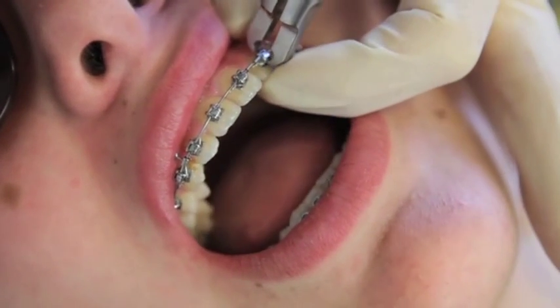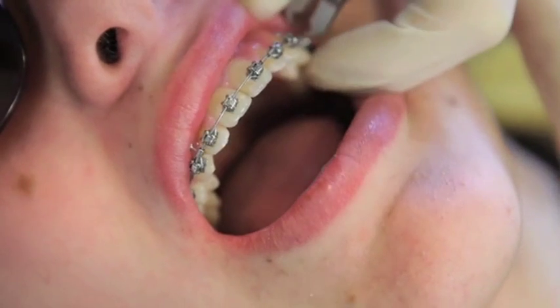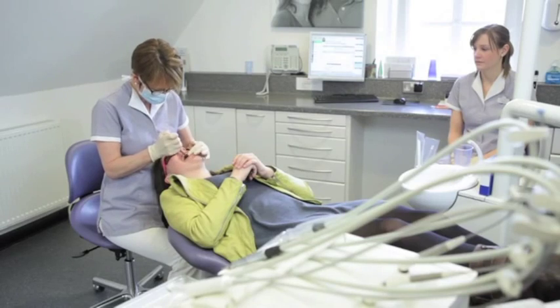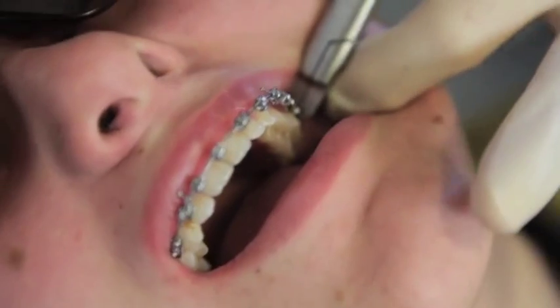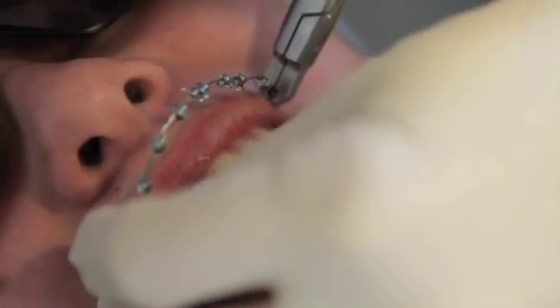We start off by gently clicking each bracket so that it just breaks away from the tooth, and then the brackets and the wires come out together in one piece. This procedure usually only takes a minute or two at the most.